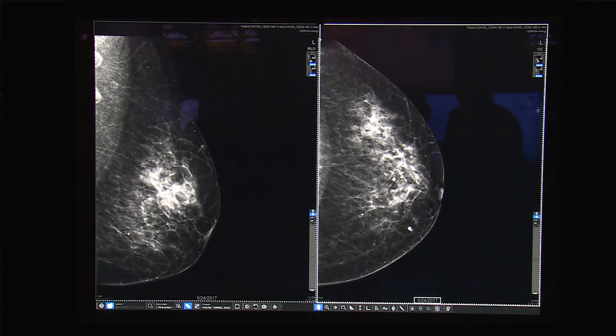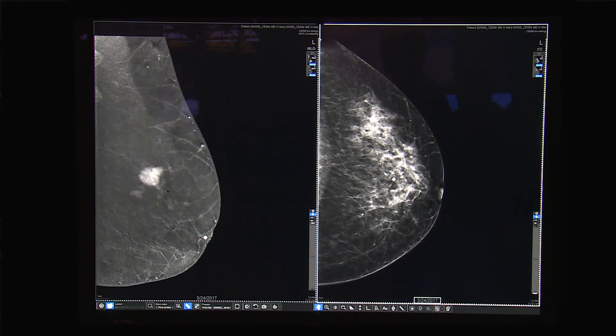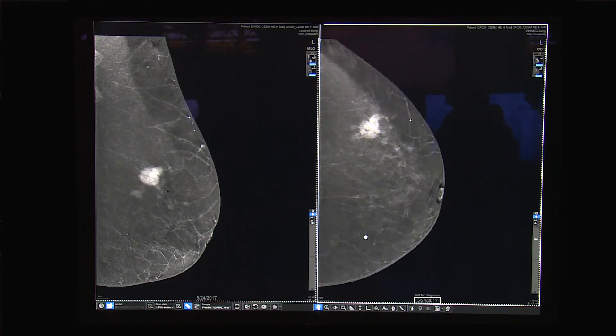In this case, the patient has an area of interest and we want to see if there is any other invasion within the breast. Looking at the low energy with the recombined, I can demonstrate that yes, the patient did have a lesion here, but she also has some stellate lesions here. This can change surgical planning and the treatment plan for that patient.